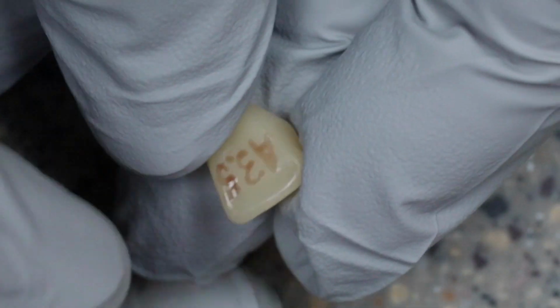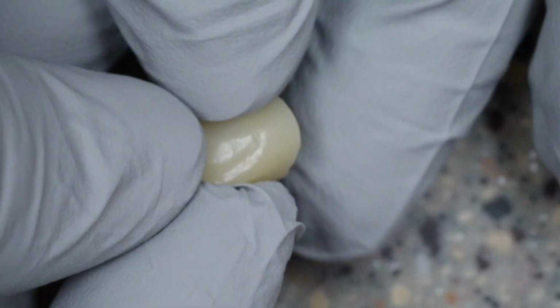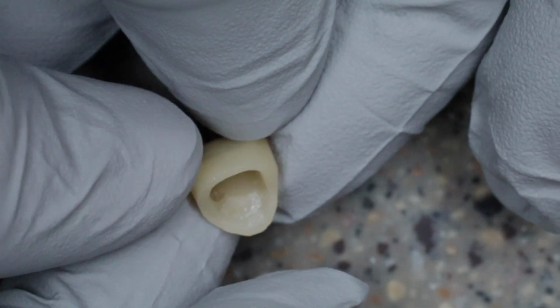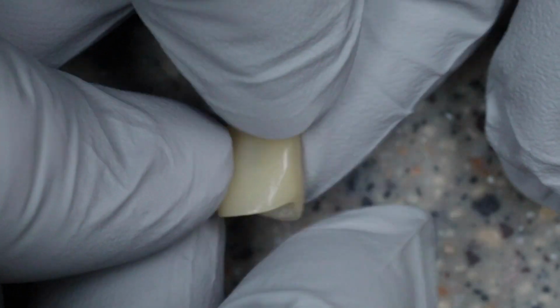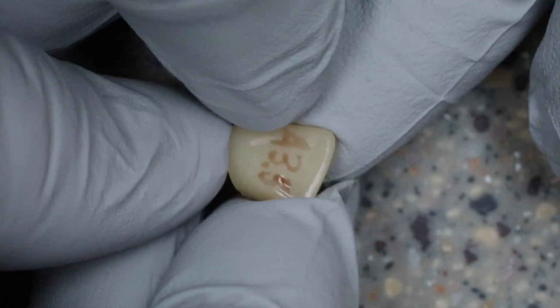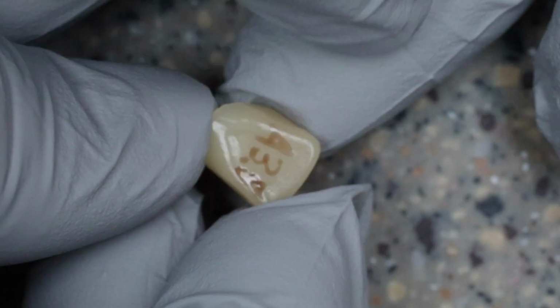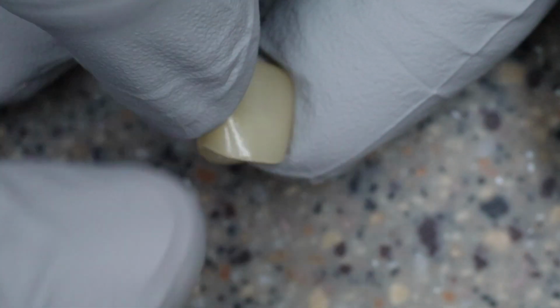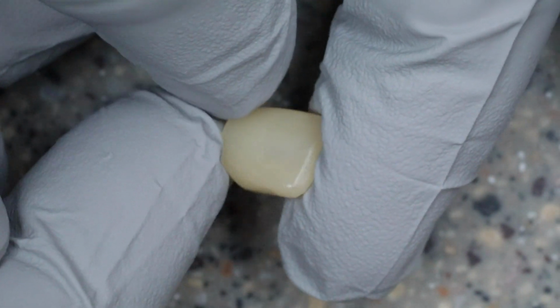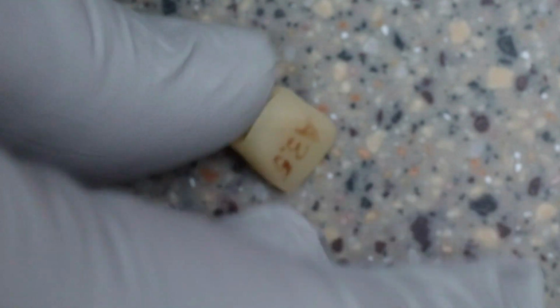All right, here's what we got. This is out of the oven. I got the Object Fix cleaned out for the most part. And we have on the back a 3.5, so that allows us to know which crown this is or what shade this represents, because again, all these crowns are going to look the same except for the shade, so that's where it's going to get a little tricky, right? All right, so let's go ahead and get this thing ready to glaze.